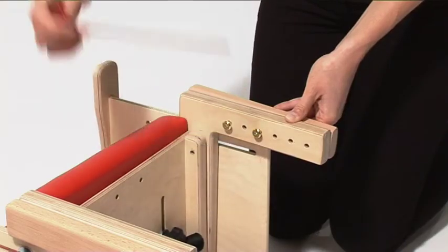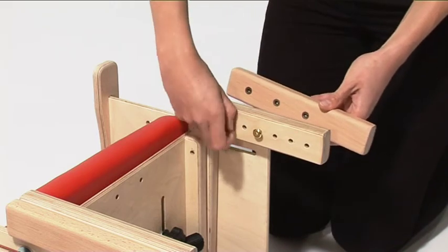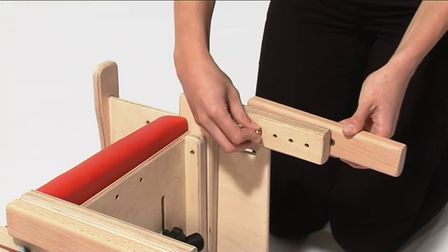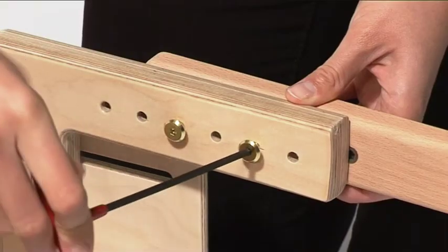To adjust the seat height, reposition the leg out triggers using the tools provided. There are two screws per leg. Ensure the screws are reinserted and tightened when the desired height is achieved.